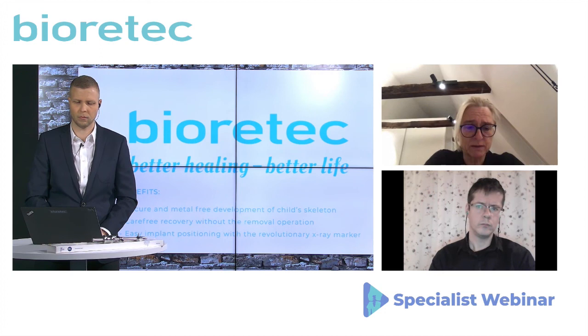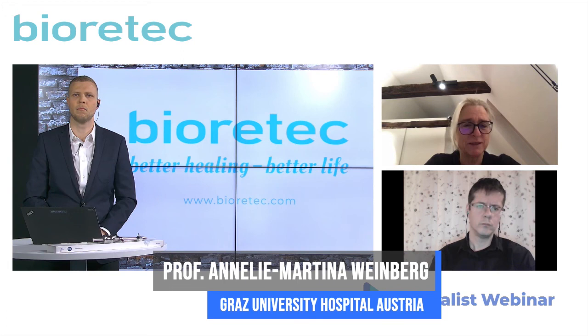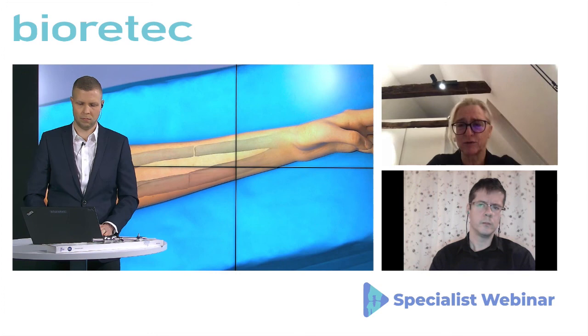I always compared it to the climate problems, you know. It's too late when you recognize that it harms the body. And in children, I would always remove implants, because this is something you have your whole life, the precipitation. Every alloying system gives ions to your body. And we know there are ions which are not normally in our body. For sure, you also get them from outside, from everywhere. But I don't want to put it into a body and say, I have done it. If we have a trigger for the immune system, we have it. So everybody has to decide on this for themselves.